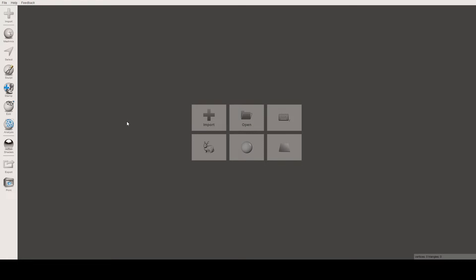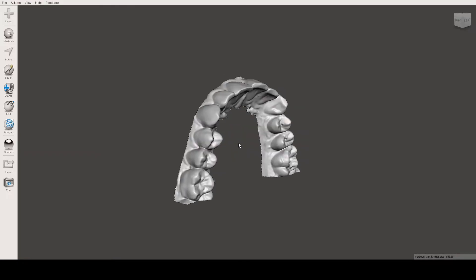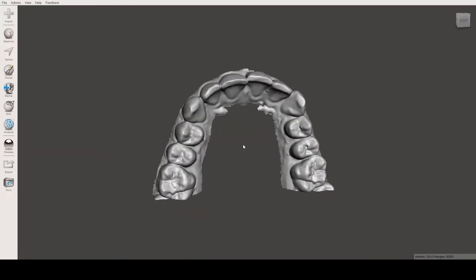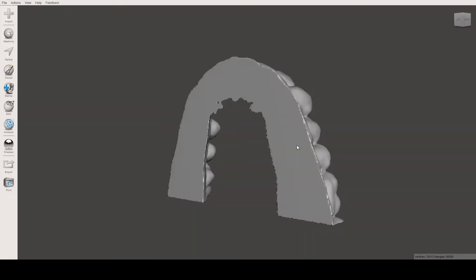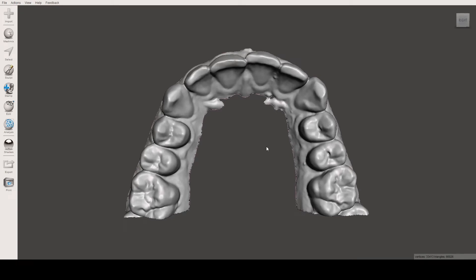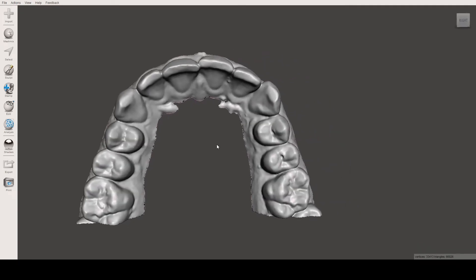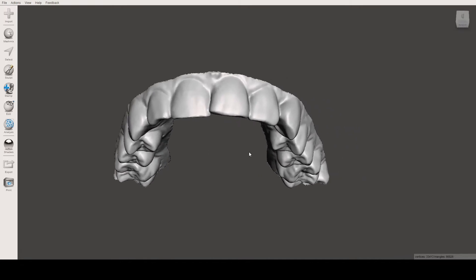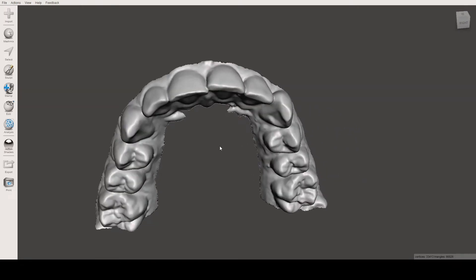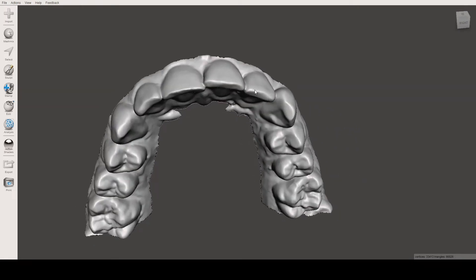Let's start creating our shell. The first step is to import our STL file. We'll use this upper arch — as you can see, I previously trimmed the model so it's ready for 3D printing or editing. For the sake of this video, I'll create the shell around these four incisors.